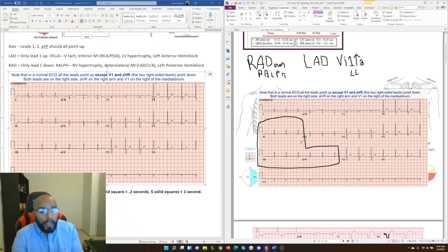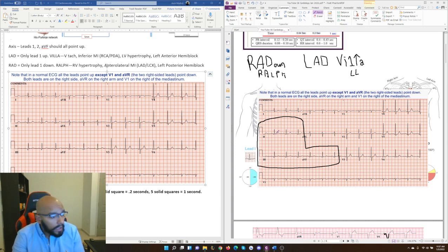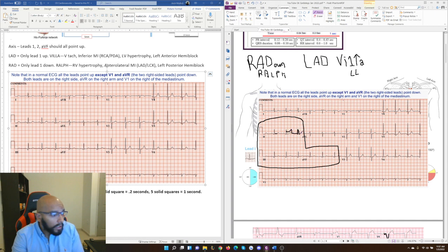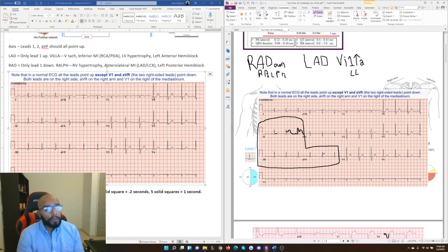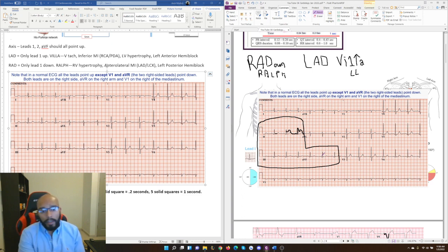For an inferior MI, depending on whether it's a STEMI or NSTEMI, you can see ST elevation or ST depression in leads 2, 3, and AVF. In ST elevation, the ST segment comes up above baseline before the T wave. ST elevation would be a giveaway for inferior MI in those leads. You then analyze what to do based on symptoms, and always make sure you answer the question being asked in the test — not a question you came up with yourself.